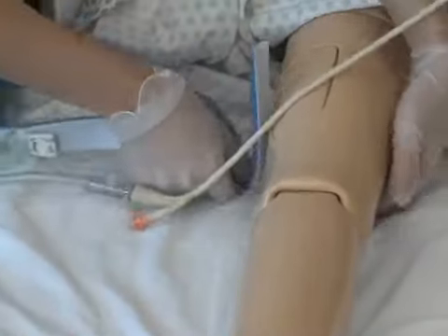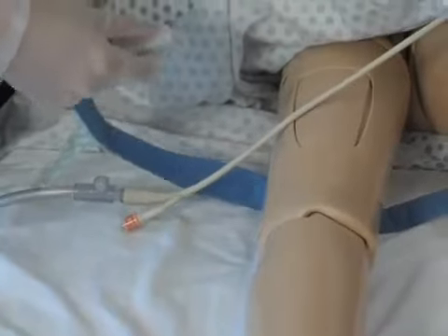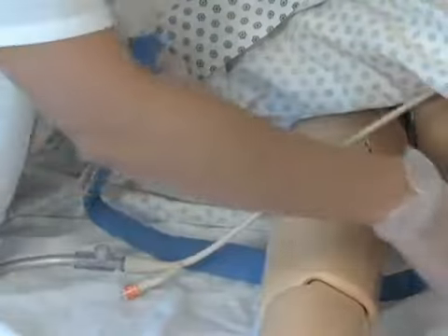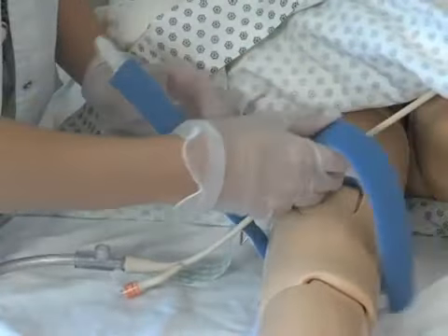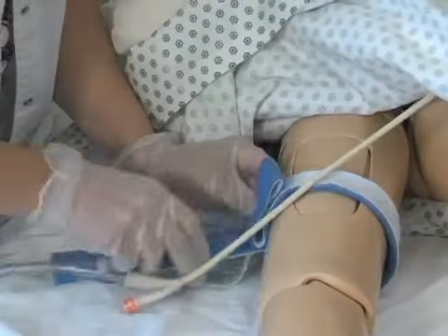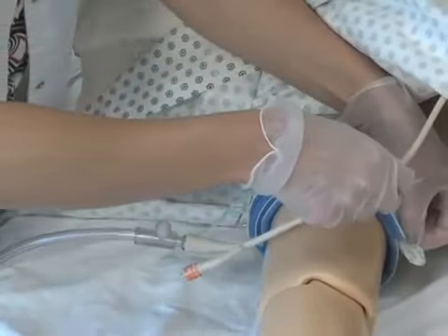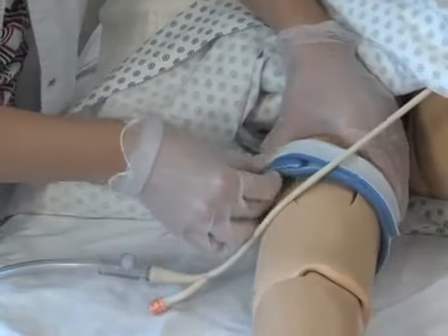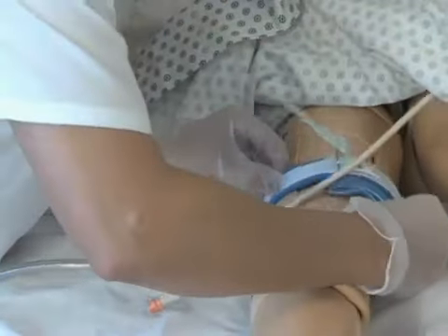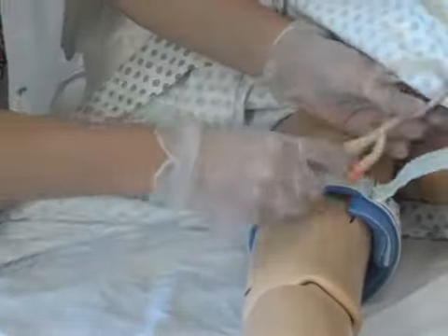I'm going to place the leg strap around the patient. Make sure that this is in the inner thigh.